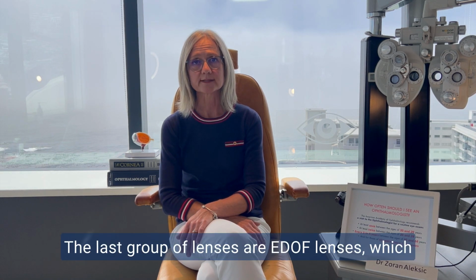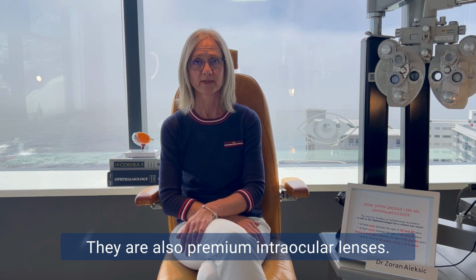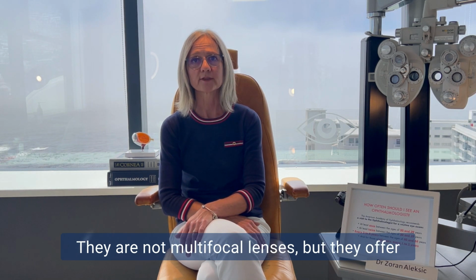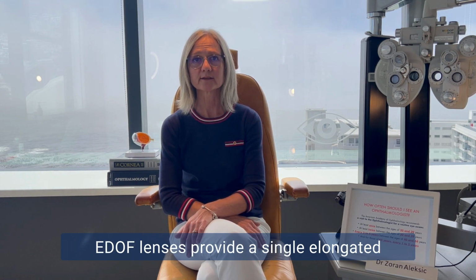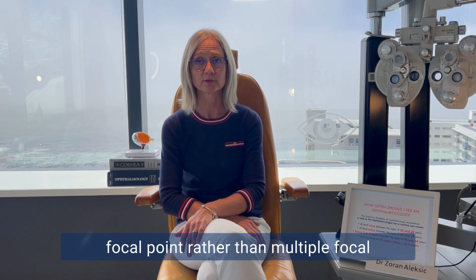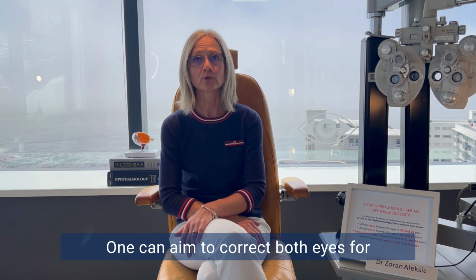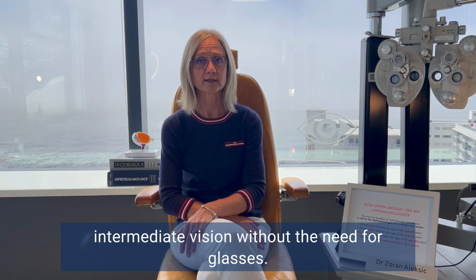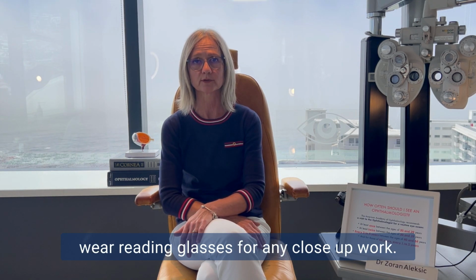The last group of lenses are EDOF lenses, which is short for Enhanced Depth of Focus lenses. They are also premium intraocular lenses. They are not multifocal lenses, but they offer more depth of focus than monofocal lenses. EDOF lenses provide a single elongated focal point rather than multiple focal points to enhance depth of focus. These lenses can be used in two ways. One can aim to correct both eyes for distance vision and then also have some improved intermediate vision without the need for glasses. In this case, one will still need to wear reading glasses for any close-up work.